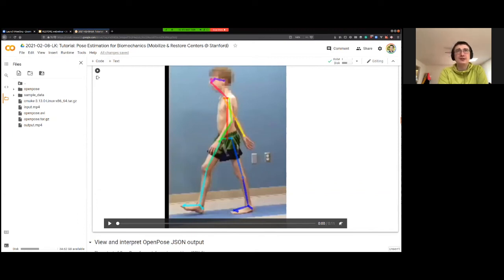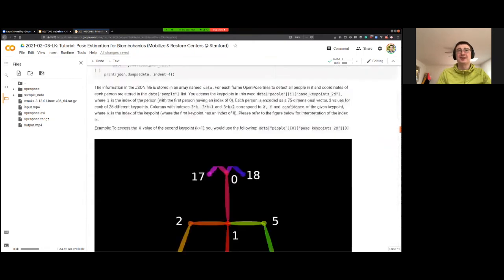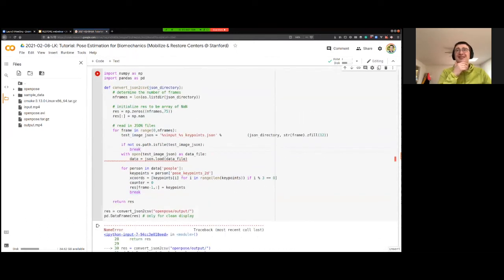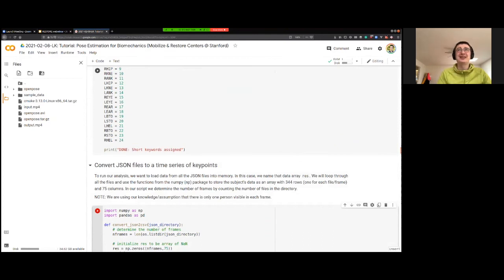as soon as you have time series data from IMUs, and as we are creating this large data matrix, we could have more time series here. Sorry, that's actually not ready. But yes, we could just combine those signals in a big matrix and do exactly what we're doing here. So as soon as you have data, you can combine.